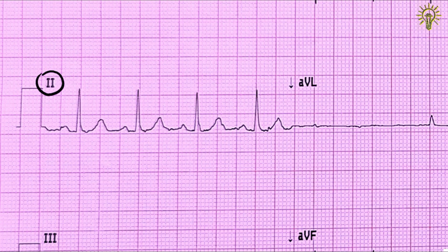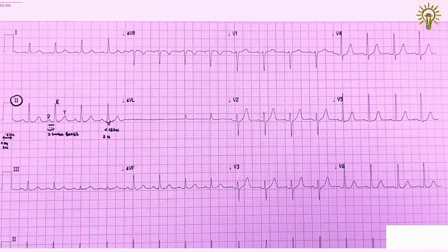At conclusion, coming back to the 12 lead ECG shown in the beginning of this video, we have seen the P wave, QRS complex, T wave. The PR interval here is almost 3 small boxes, so around 0.12 seconds, which is in normal range. The QRS complex is barely 2 dots wide, meaning it is narrow QRS, meaning the depolarization wave followed usual normal conduction pathway. The blue highlighted P wave is negative in AVR, which is normal.